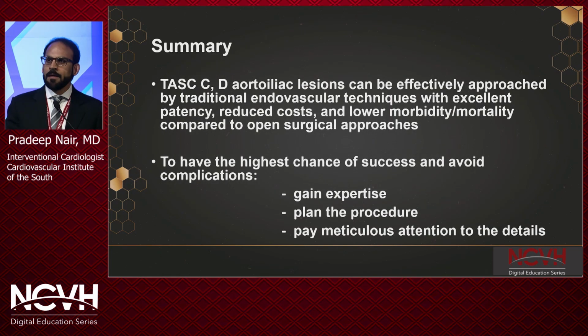So in summary, TASC C and D aortoiliac lesions can be effectively approached by traditional endovascular techniques with excellent patency, reduced costs, and lower morbidity and mortality compared to open surgical approaches. And to have the highest chance of success and avoid complications, gain expertise, start with the lowest risk cases first, plan the procedure, and pay meticulous attention to the details.